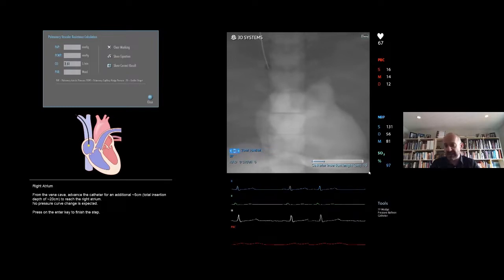So next thing here is you'll notice your pressure down there. See the red line where the pressure is. You are in the superior vena cava. And now I see it's advanced a little bit. Now it's 17 centimeters. That is the junction between the superior vena cava and RA. The pressure looks about the same, and if you keep advancing, so let's say we keep going, now we're about 20, 22, so now we're in the right atrium.